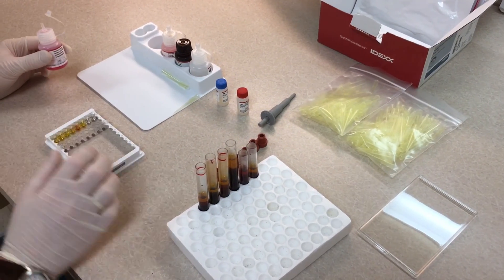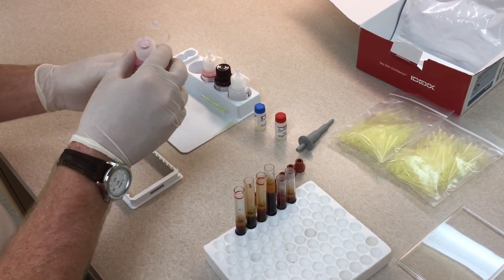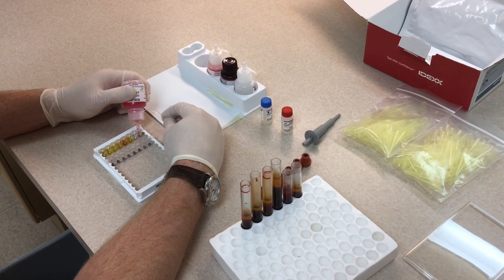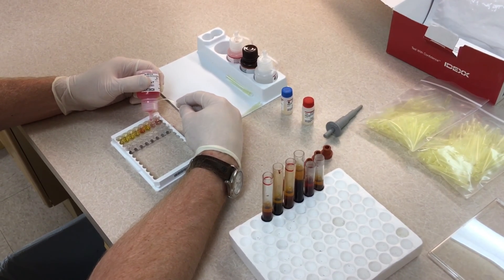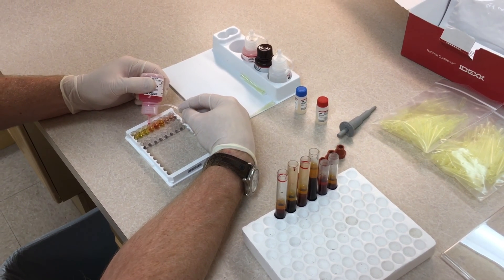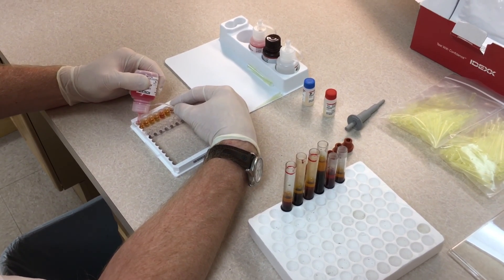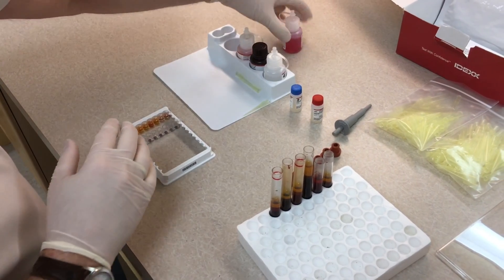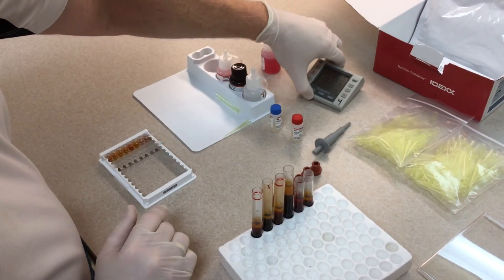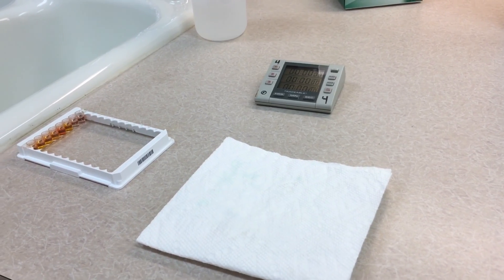Once all samples are in the wells, use the first reagent — the detector reagent — and put three drops into each well. Start with the positive control, three drops, then the negative control, three drops, then three drops in each of your sample wells. Once that's done, put the cap on and set your timer for a seven-minute incubation period.